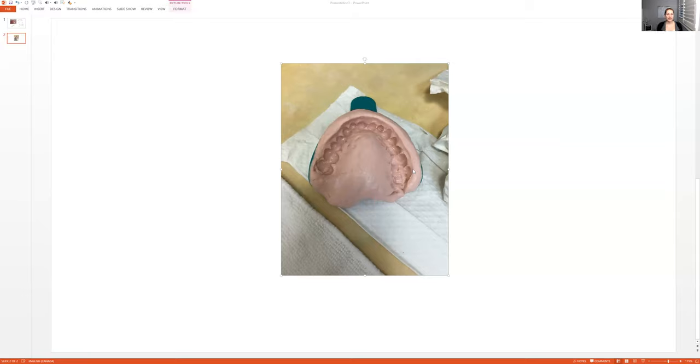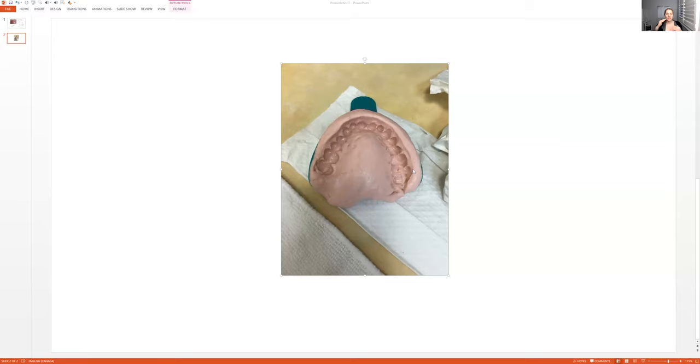To check to see if the alginate has set, there will always be a mess like on the outside. And it's hard to picture, but the alginate tray does stick out. Right. So the material will be overflowing a little bit. So then you can check like on their tray if it's set or not. If it's still mushy, it hasn't set.